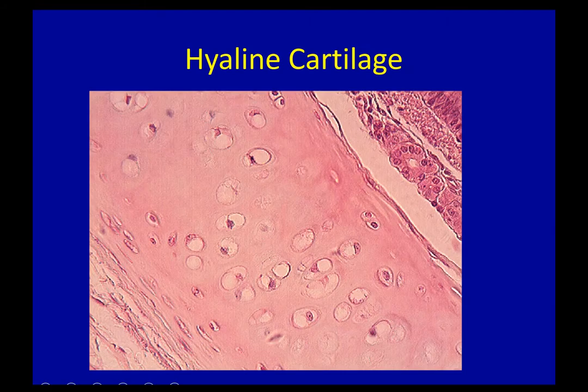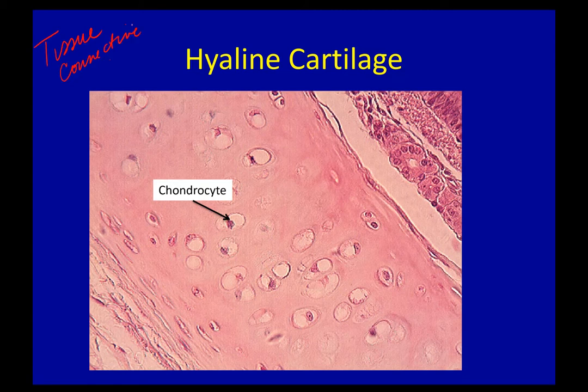So let's go through them individually. Hyaline cartilage. Type of tissue: connective tissue. Identify the slide: this is hyaline cartilage. How do I know that? Look at the jello. Are there any stringies in the jello? No. And I do have deviled eggs sitting in jello.